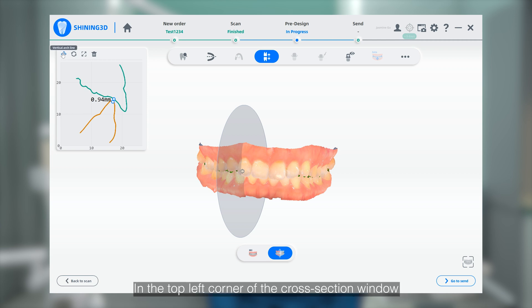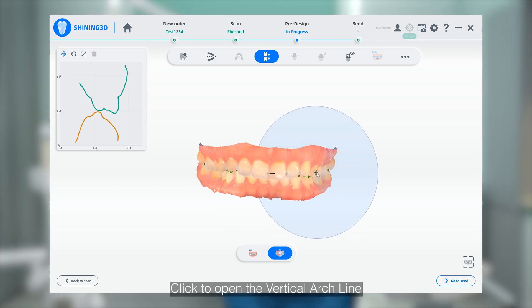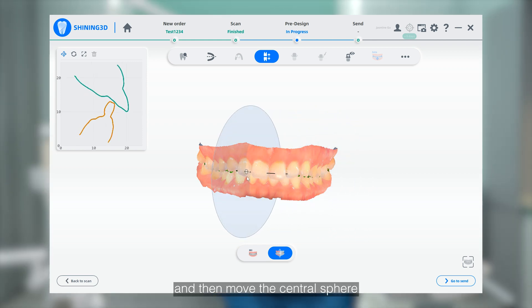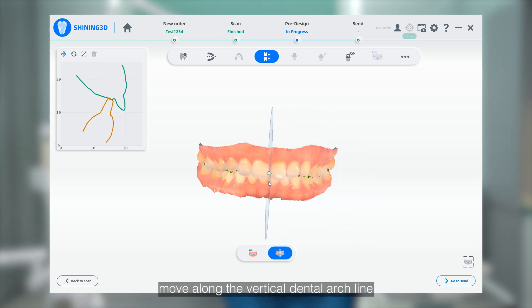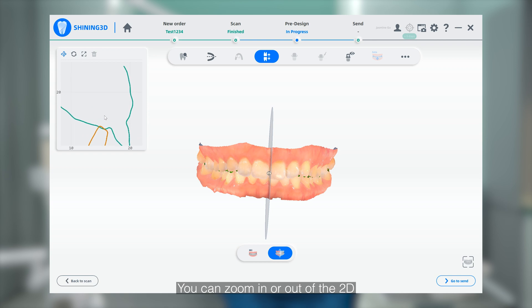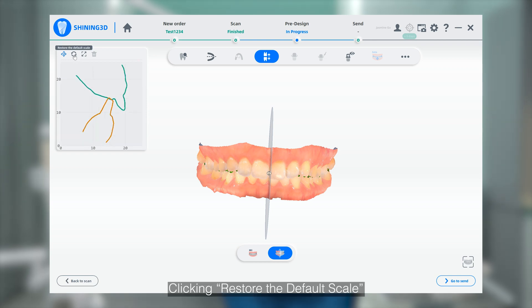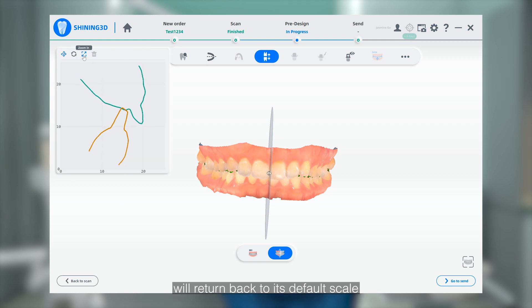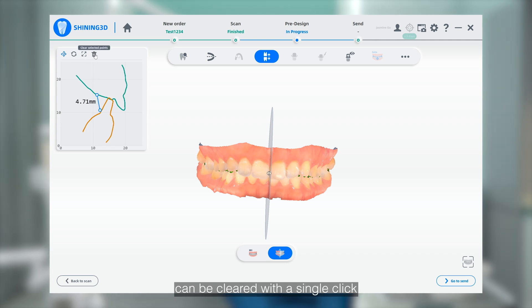In the top left corner of the cross-section window, you will also find some tools. Click to open the vertical arch line and then move the center surface — the dental arch section will automatically move along the vertical dental arch line. You can zoom in or out of the 2D cross-section view using the mouse scroll wheel. Clicking 'Restore default scale' will return it to its default scale. Clicking the zoom-in icon enlarges the entire window, and the points selected for measurement can be cleared with a single click on 'Clear selected points.'